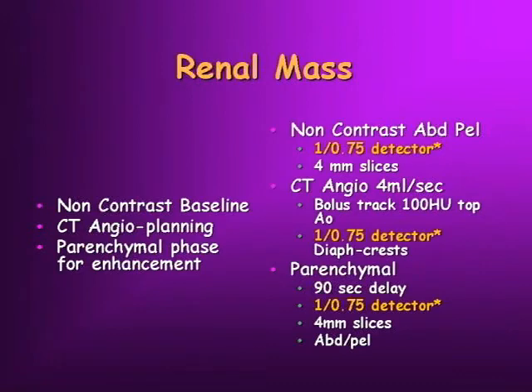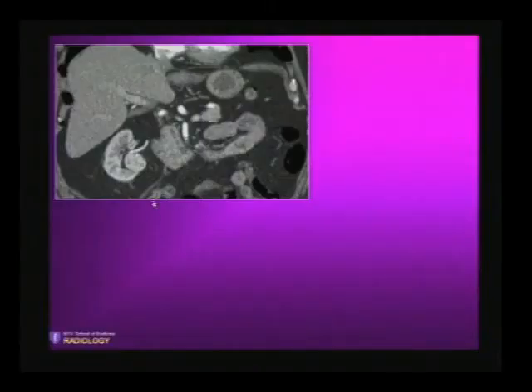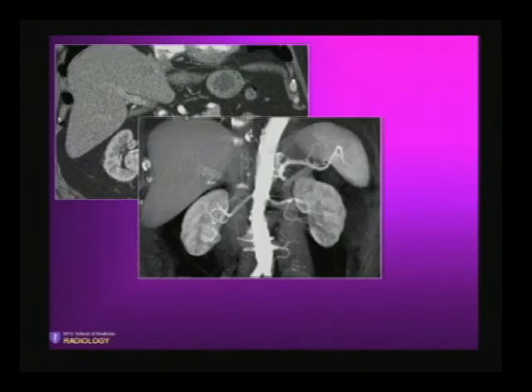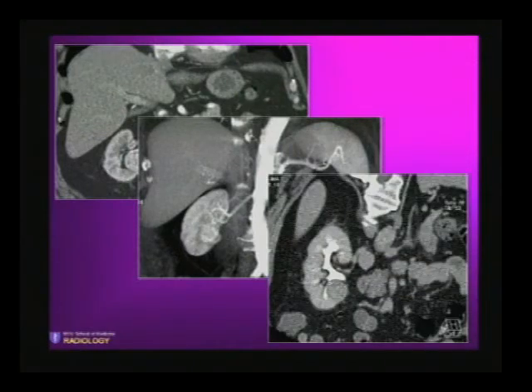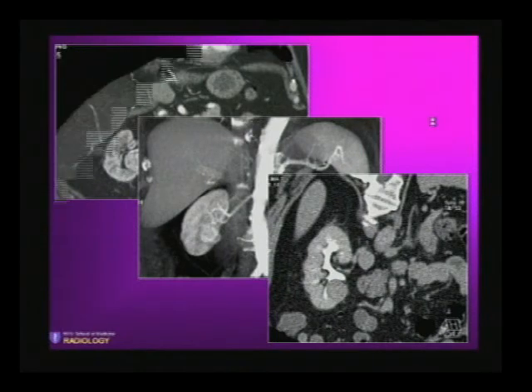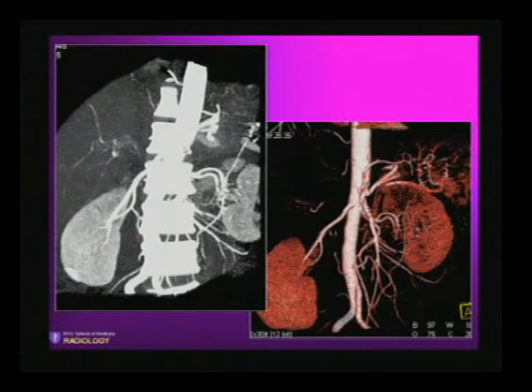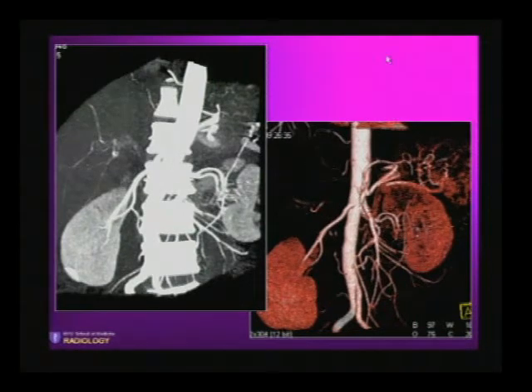For renal mass, we need a non-contrast, a renal angio for planning, and a parenchymal phase for enhancement — a triple phase acquisition. Here's an example from last week: a small renal mass being evaluated for surgery. You can see the mass, and on the CT angiogram a single renal artery supplying the lesion with early branching — pre-hilar branching with a large vessel that can also be shown supplying the tumor on MIP images. Very useful information to the laparoscopic surgeon. A delayed image shows the relation to the collecting system — pressing but not invading the renal sinus. With bone removal, we can see the renal artery very beautifully on volume rendering.